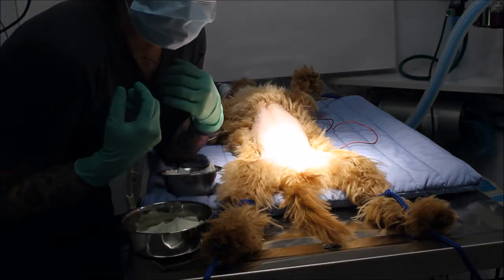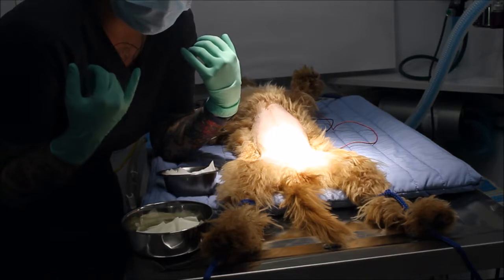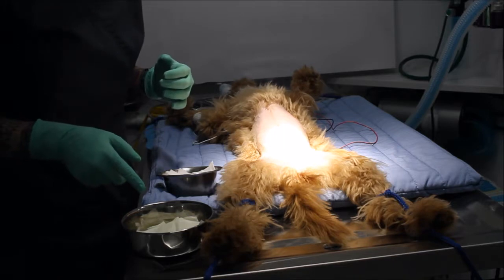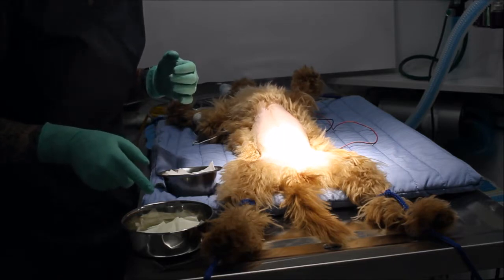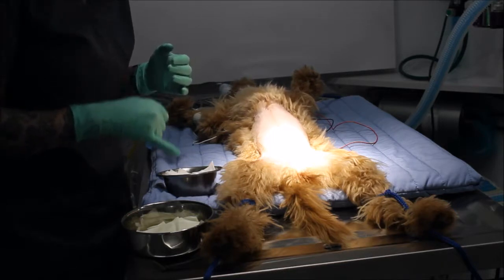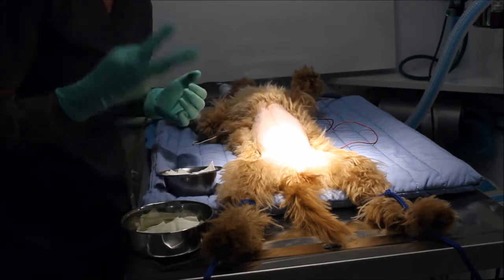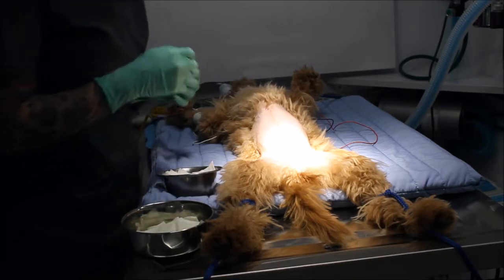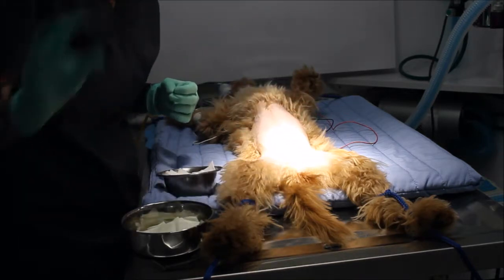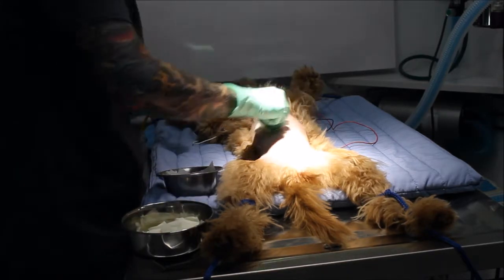Now that we've done our dirty prep, we're going to go ahead and do our final prep. I have my mask and cap on, and I've changed my exam gloves just to make sure they're clean. In this bowl I have my 2% chlorhexidine gluconate scrub solution, and in this other bowl I have my 70% isopropyl alcohol as the rinse. We're going to scrub and rinse a minimum of 3 times or until it comes up clean. Again, we're going to do a target pattern starting at where the incision line would be and work our way out — once we touch hair, we discard. I'll go ahead and start with the chlorhexidine and just work outward.